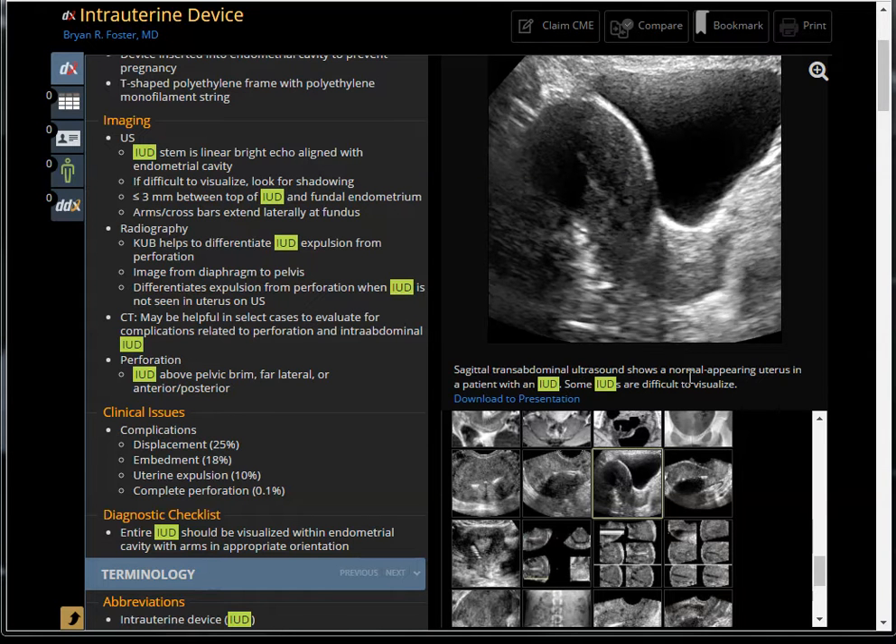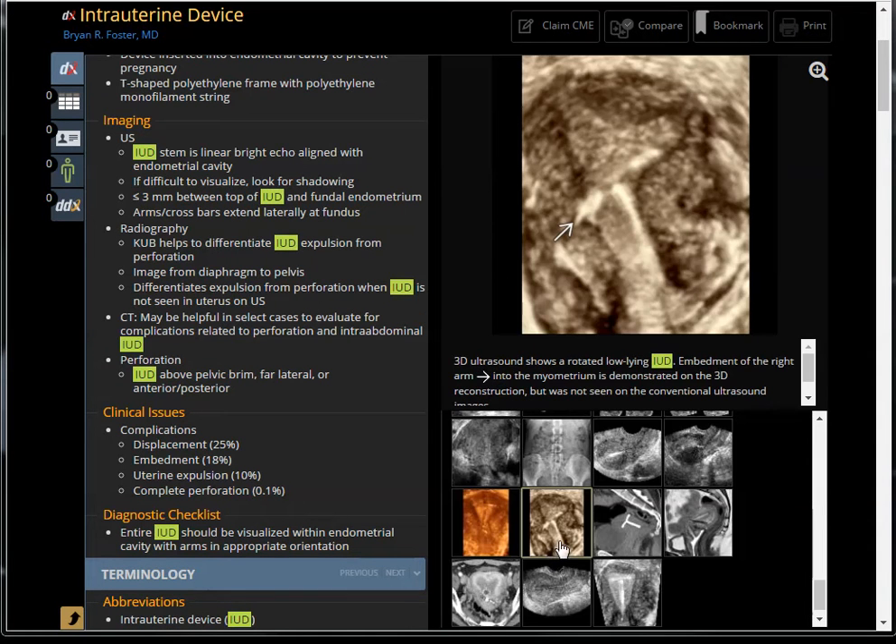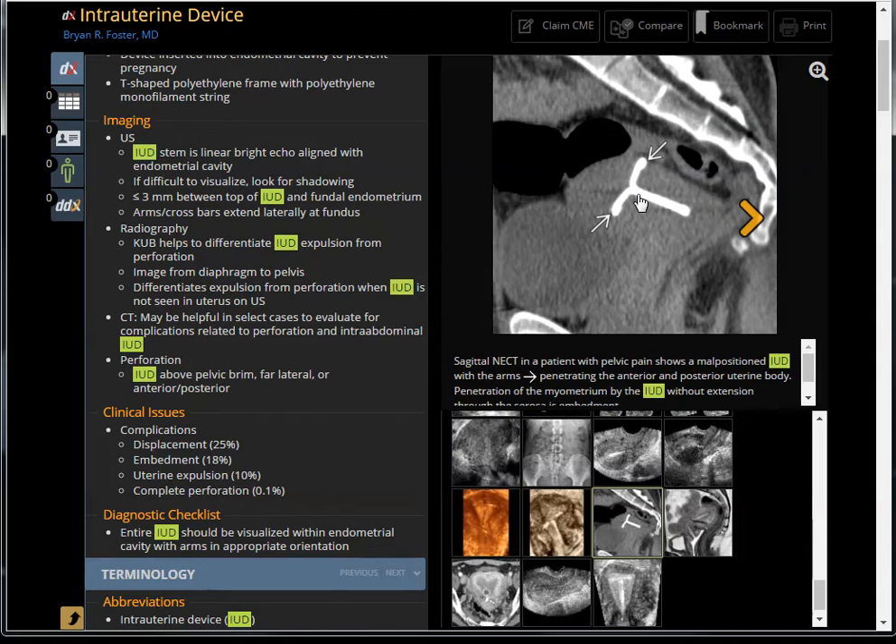This image shows a normal-appearing uterus in a patient with an IUD. Some IUDs are difficult to visualize, like this case — remember this case because I'll have a corollary to it later. Sometimes the IUD is deployed and the arm can punch into the wall — this is called embedment, so it's not in the correct location. The T-shape should be here, but now it's tilted and embedded. Sometimes it turns 90 degrees and pokes through the myometrium.